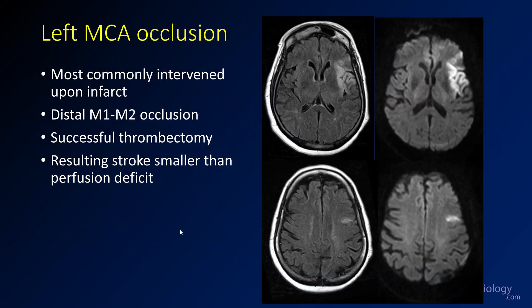This is a left MCA occlusion — the most commonly intervenable infarct. In this case, it was in the distal M1 extending into the M2. This patient got a successful thrombectomy. You can see there is an area of FLAIR abnormality along the insula in the lateral frontal lobe along the sylvian fissure, and on diffusion there's an area of completed infarct there.